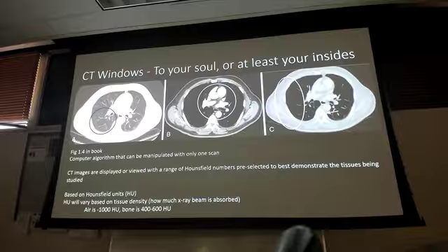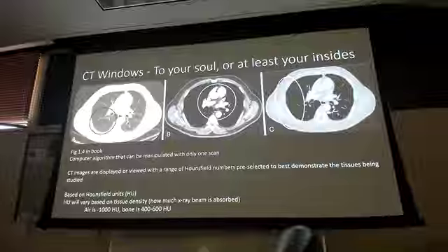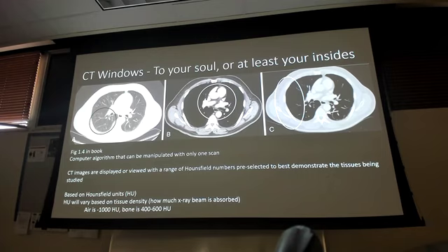Look at what it did to all the soft tissue in the bones. It whited it out, right? That's not very detailed. I can't really see it that well. But boy, does that lung tissue, and the vasculature in the lungs really pop out. I can really see that tissue and all of the vessels in the vasculature. So that's really good for looking at lung tissue concerns.